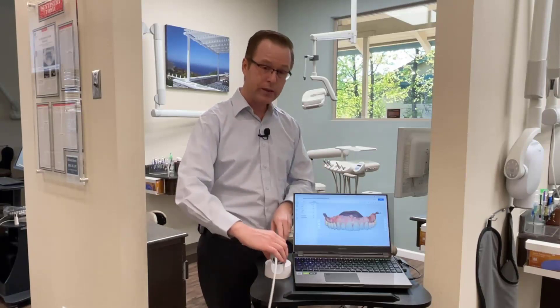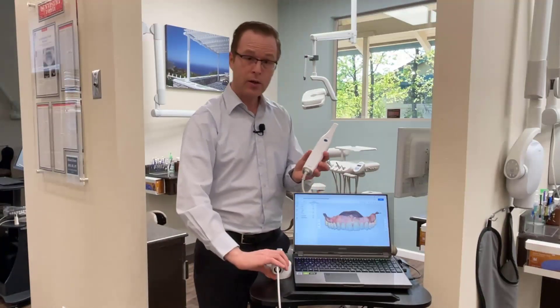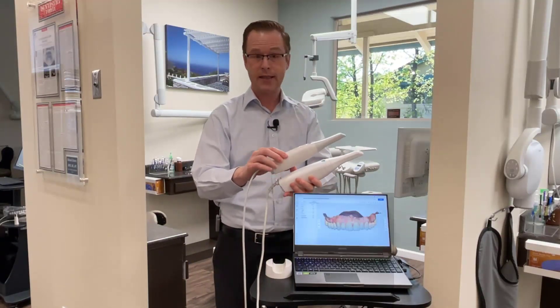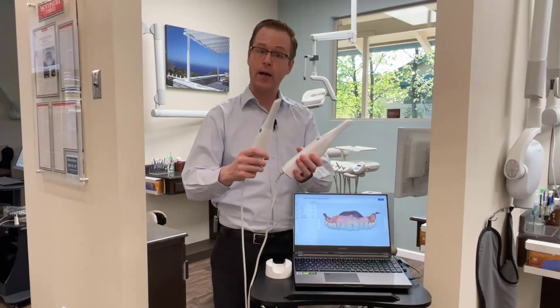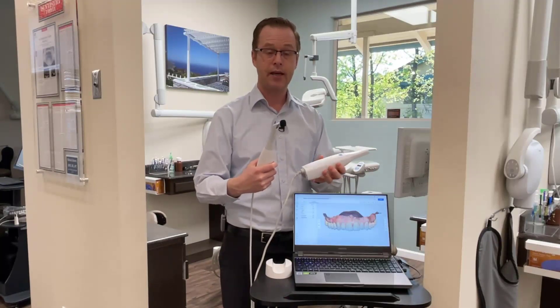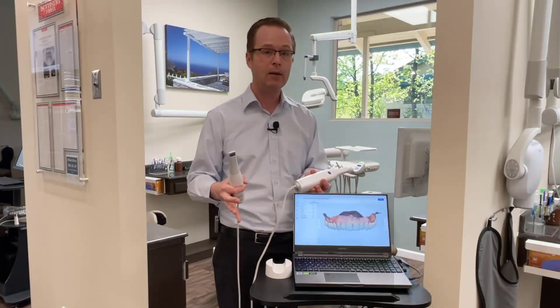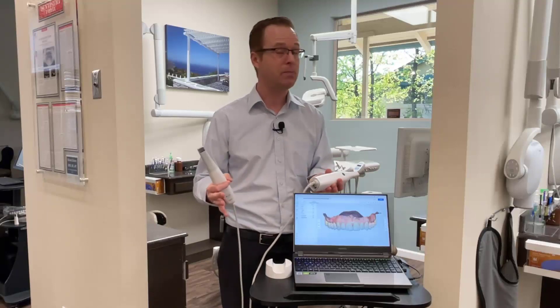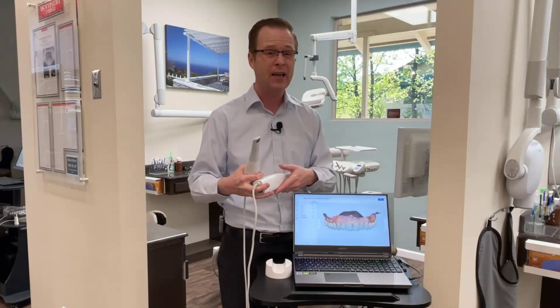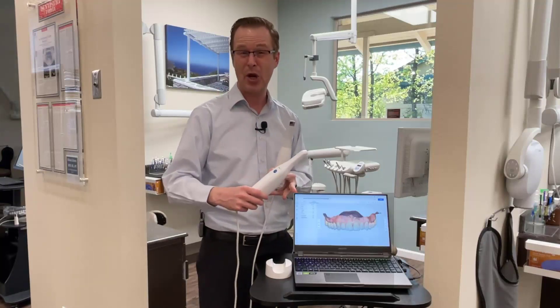Between all of those really interesting features, the Medit i700 compared to the Medit i500, you can really see the difference between the two. From a distance, you might not notice it right away because they look very similar. But you'll instantly feel the weight difference once you pick them both up, and you'll instantly feel the size difference in your hand. Medit says the cable lengths are about the same, but it feels like the i700 has a little bit longer cable — maybe an additional couple of inches. I'll leave it to my viewers to let me know if that is the case.